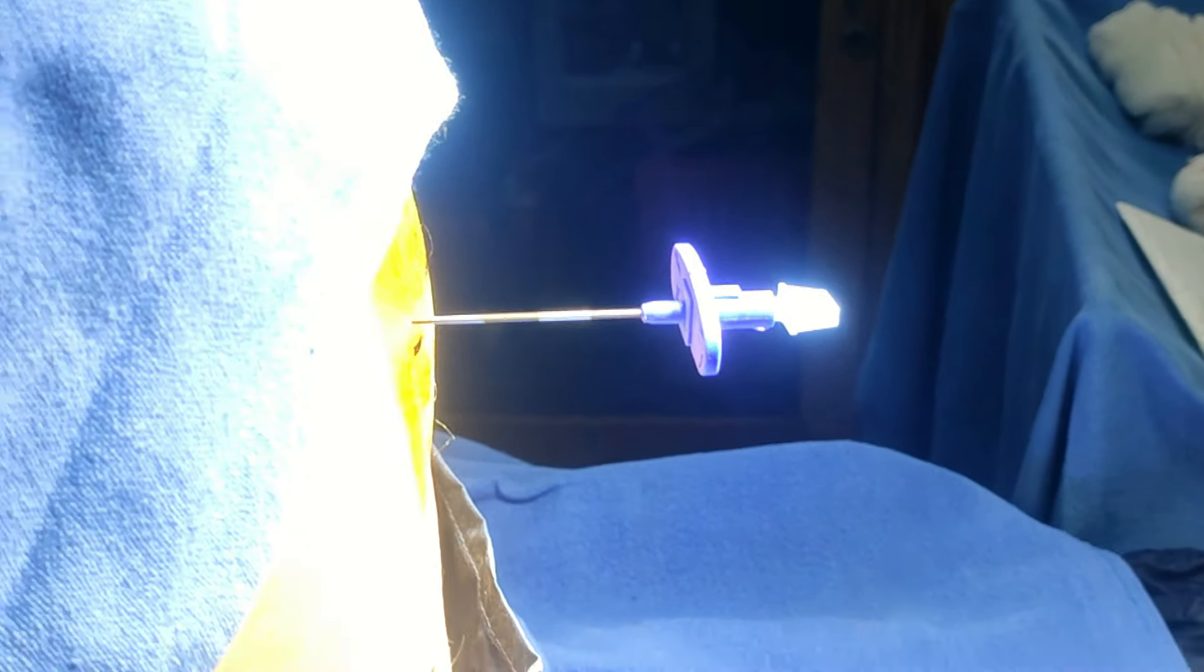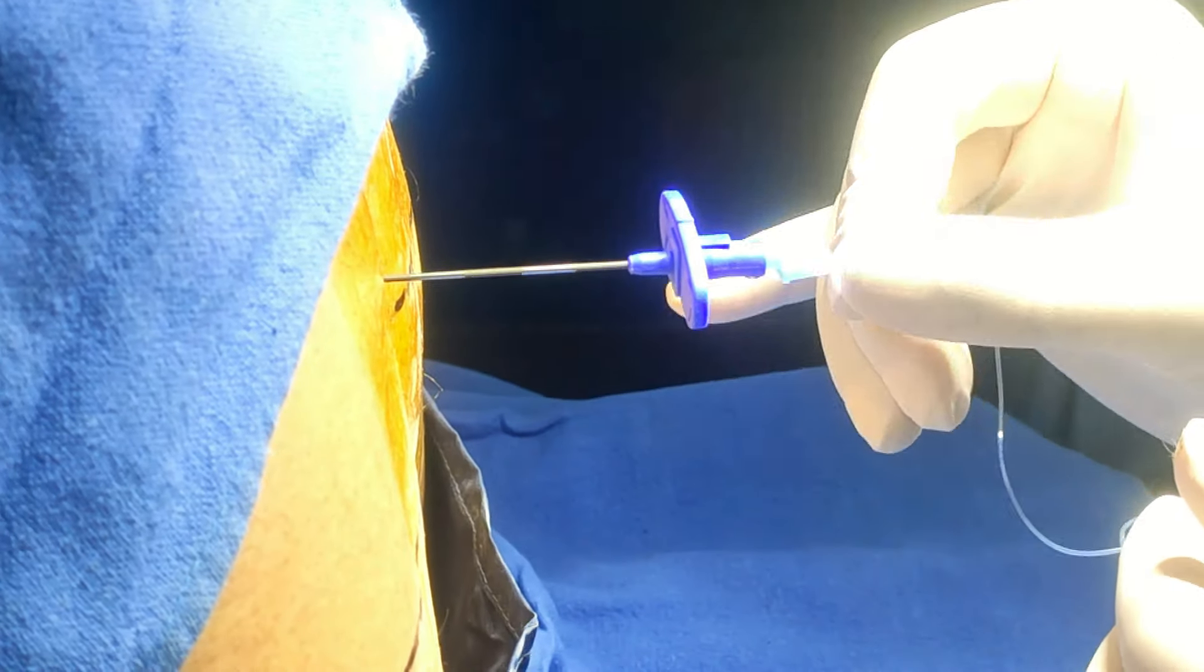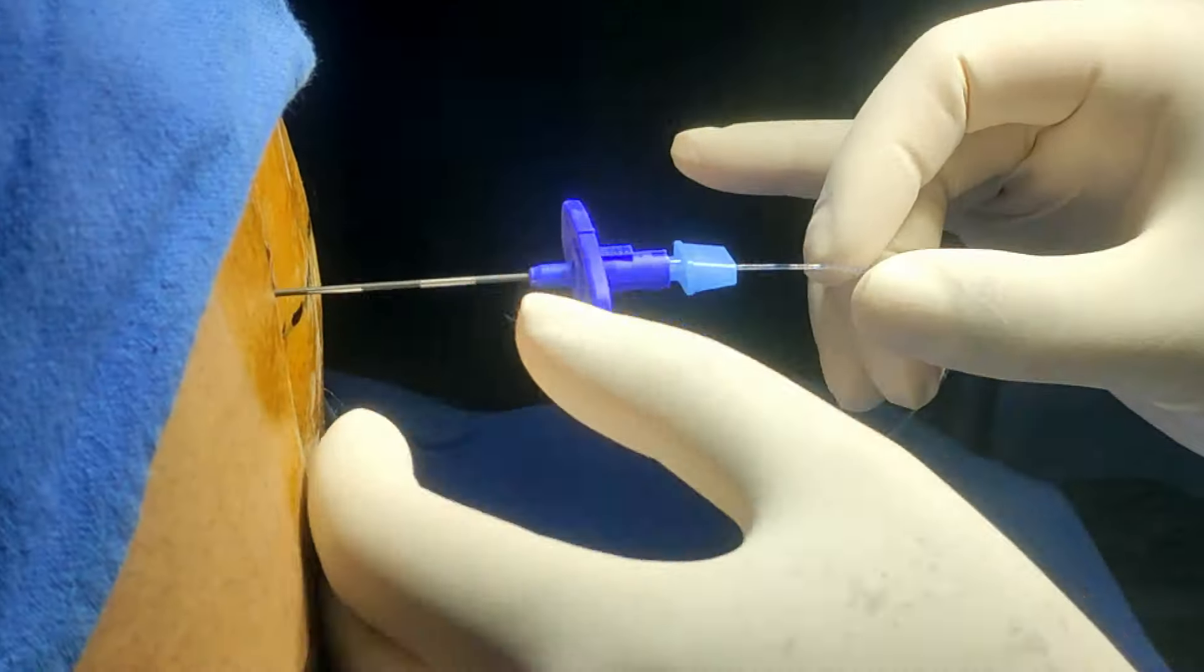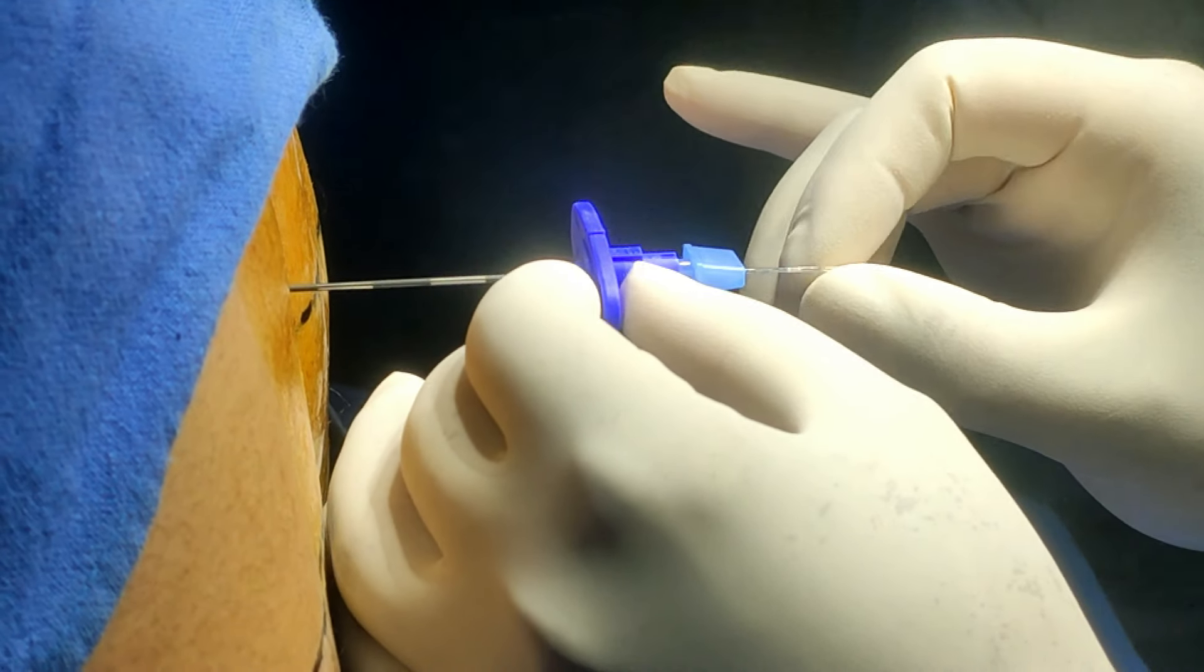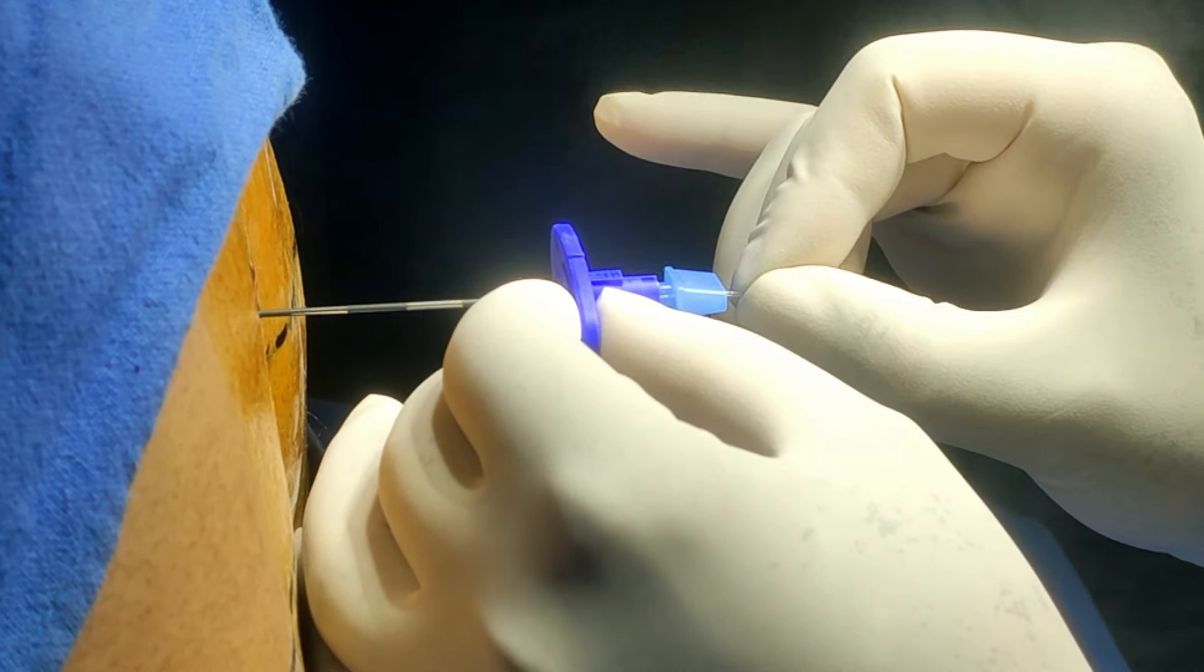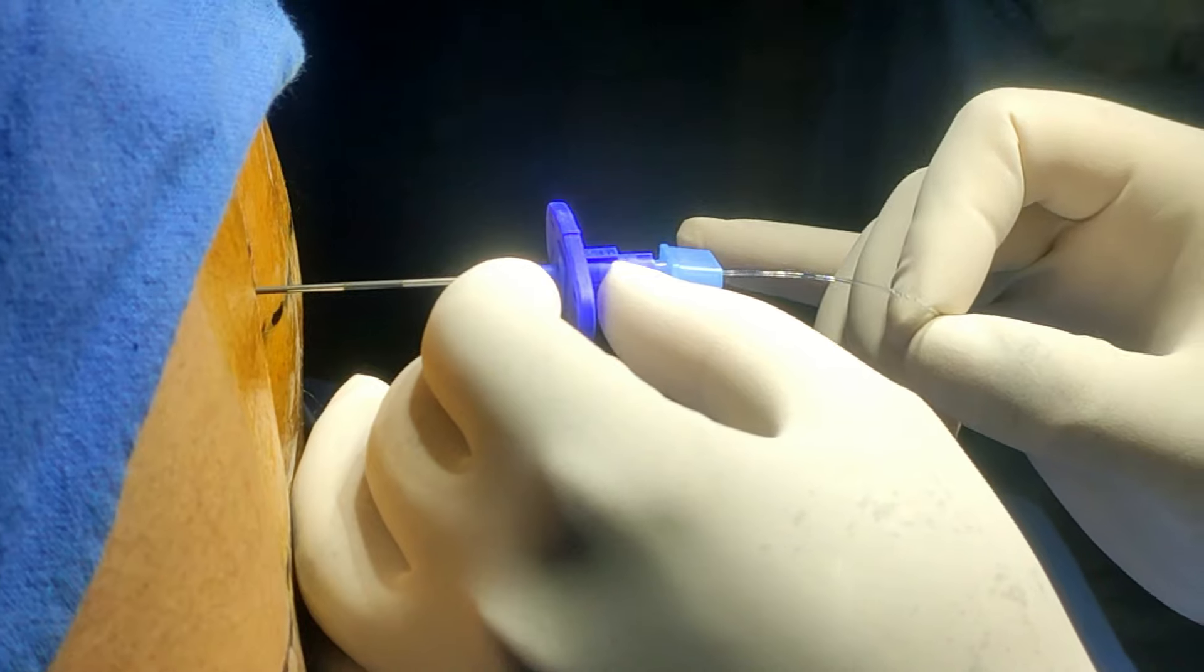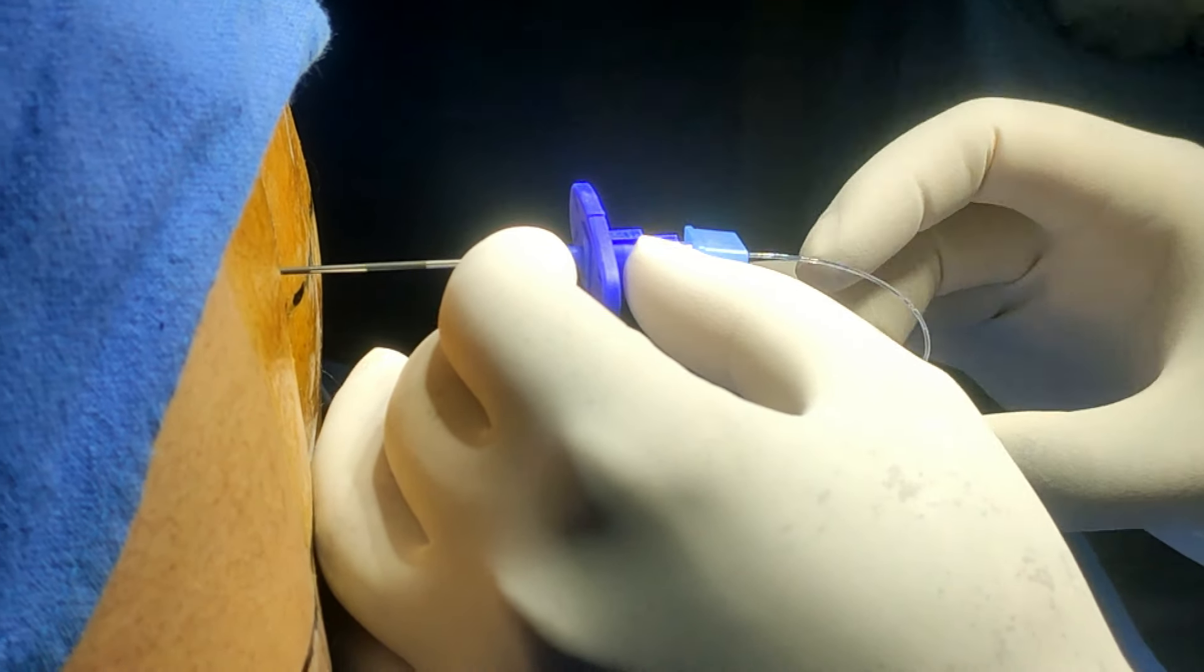This is not the spinal fluid here. Now I will guide it, this much amount, about three centimeters.